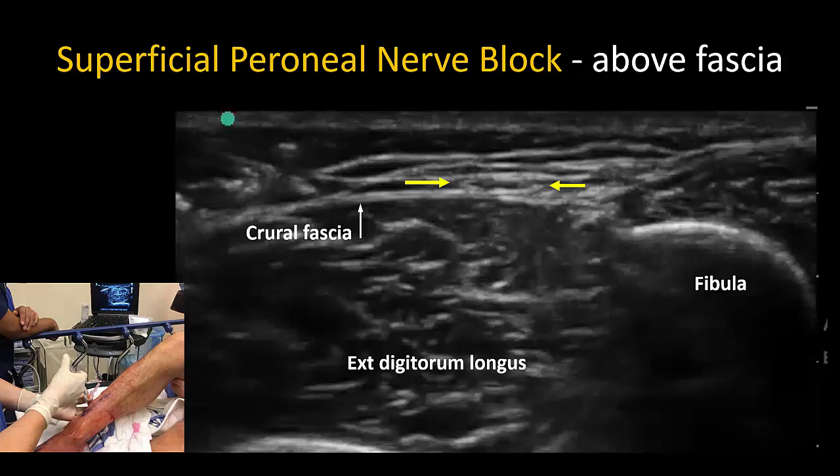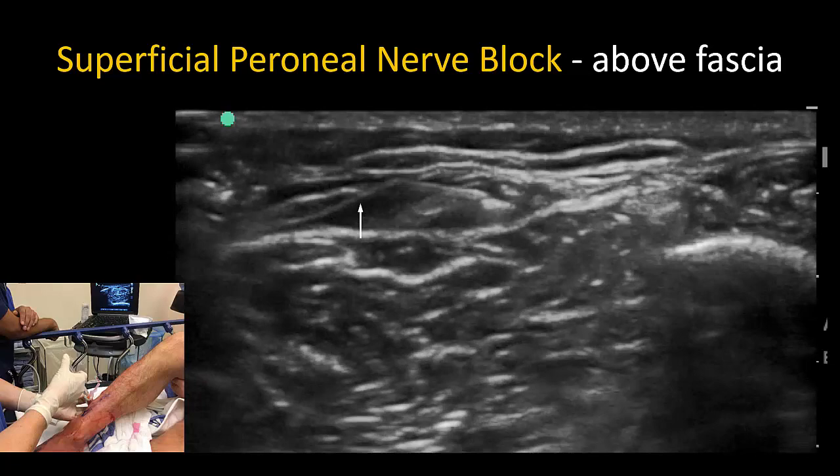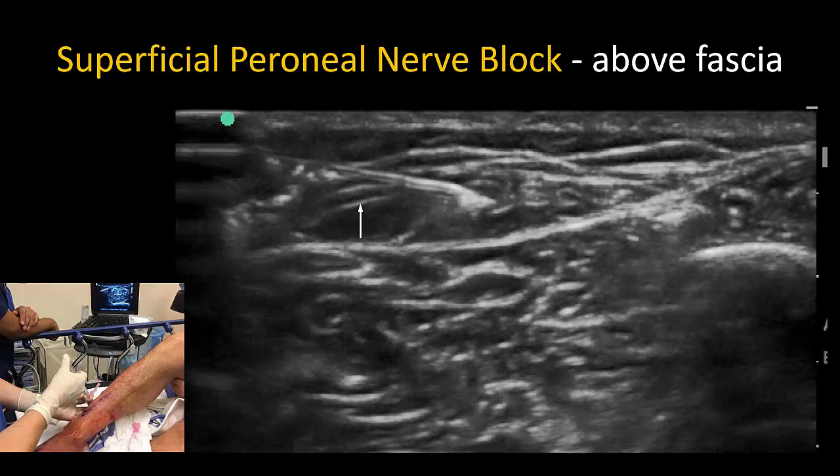Note that the nerve often has a flattened appearance, especially in slim people, but it will expand as the subcutaneous layer is distended. Insert the hypodermic needle into the subcutaneous tissue and position the tip in the correct plane. Inject with enough force to create a jet of local anesthetic that surrounds the nerve. The needle tip does not need to touch the nerve and should not be allowed to.